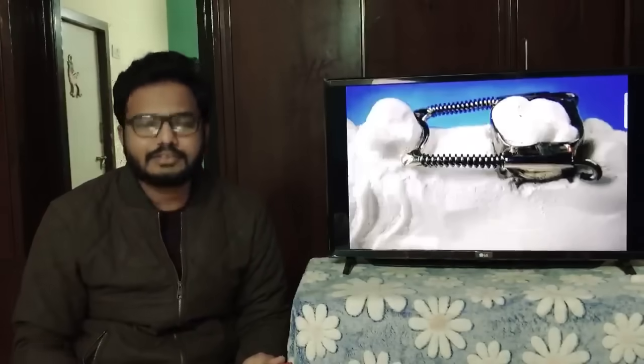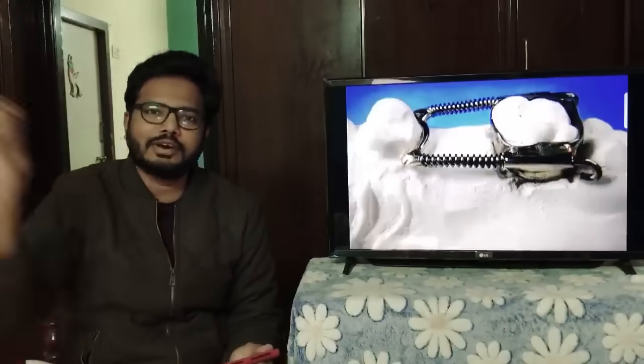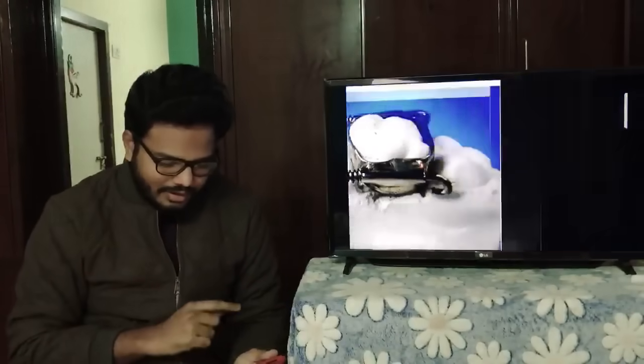Good. It's not band and loop. Yes, it's a space regainer. Wonderful. Now let's move on to the next one.